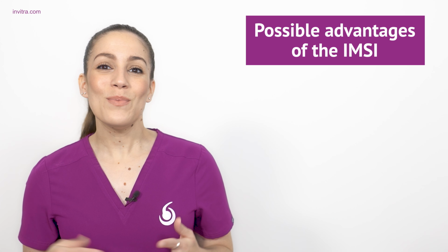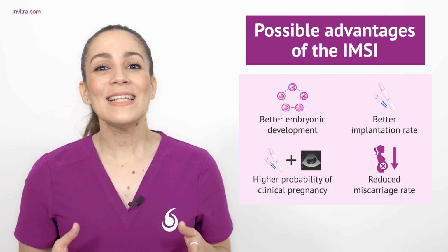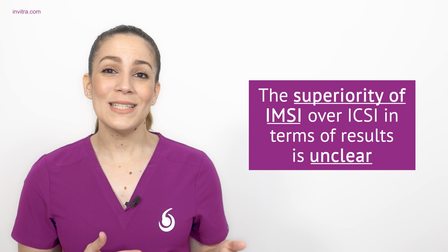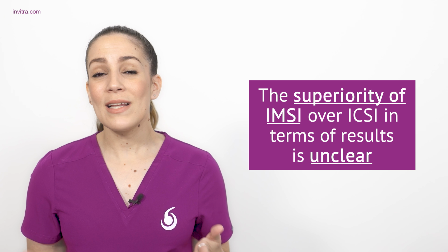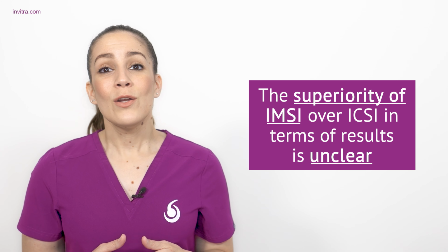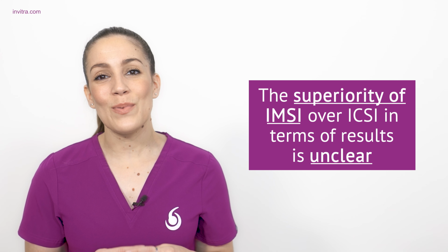With the implementation of IMSI, there could be an improvement in embryo development to blastocyst, implantation, and clinical pregnancy rate, and a reduction in miscarriage rate. However, the superiority of IMSI over ICSI is still not very clear in terms of improving these outcomes. This means that the IMSI technique is not a standard or routine procedure in current practice in assisted reproduction clinics.